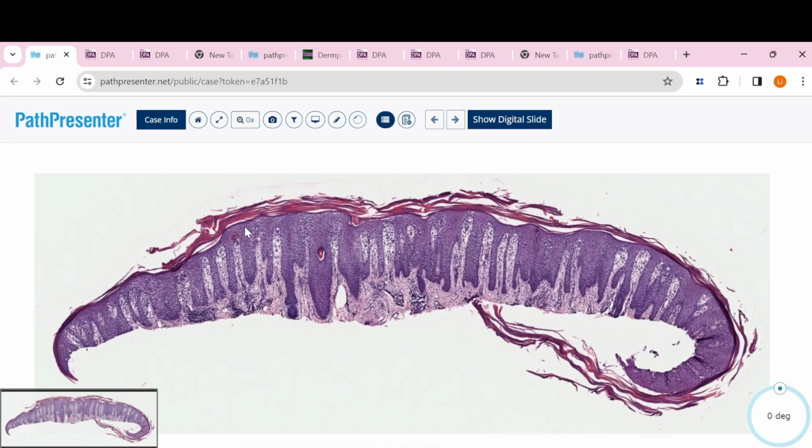Then we usually do not see spongiotic dermatitis. But if the patient feels kind of itching, they scratch, you will see that, like here, just a little bit. But the spongiosis would not be your main thinking in psoriasis. Then we have this regular elongation of the rete ridges. Regular means we have the same level of all the rete ridges, like here. That is regular for psoriasis.